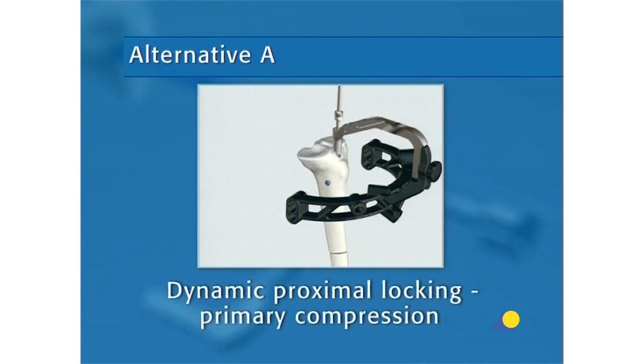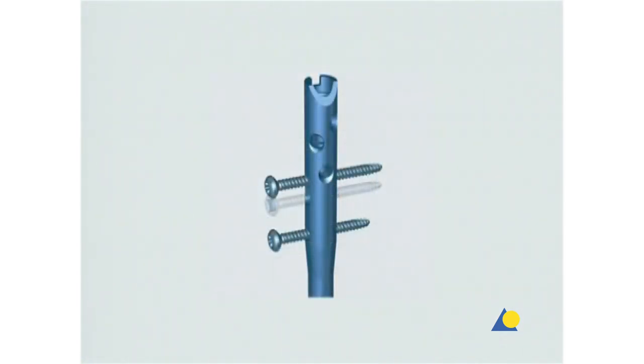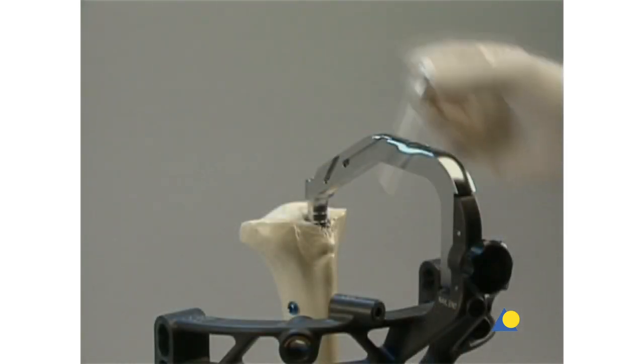Alternative A: Dynamic Proximal Locking — Primary Compression. The following instruments are needed: the protection sleeve, the drill sleeve with blue and yellow markings, the trocar with blue and yellow markings, the compression screw, and the calibrated 3.2mm drill bit with blue and yellow markings. In cases of diastasis, compression of the fracture gap may be necessary. The expert tibial nail allows a maximum compression of 7mm. The compression screw is inserted into the connecting screw until it comes in contact with the locking screw; each complete turn corresponds to 1mm of compression.